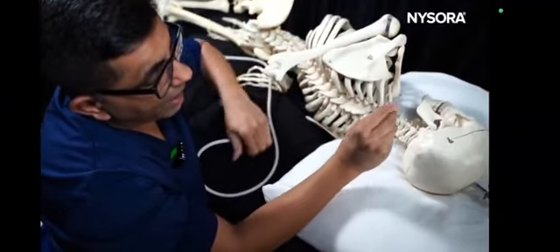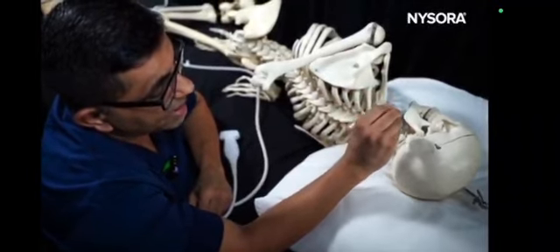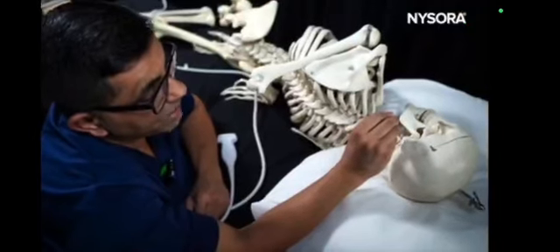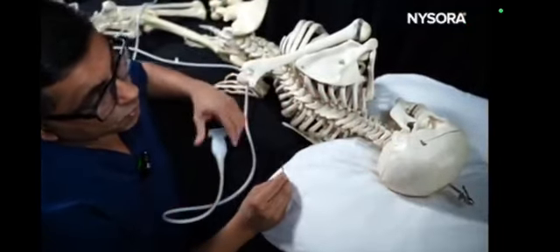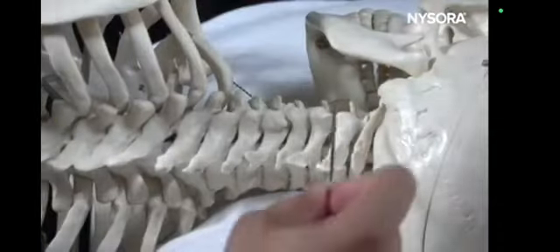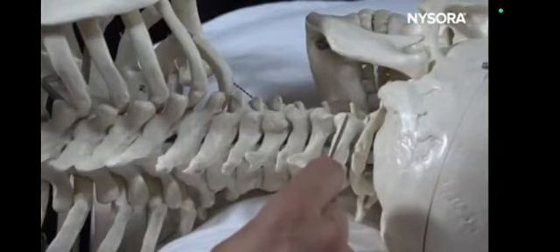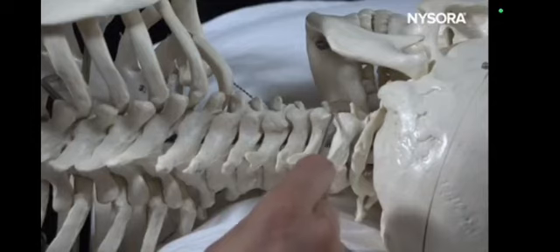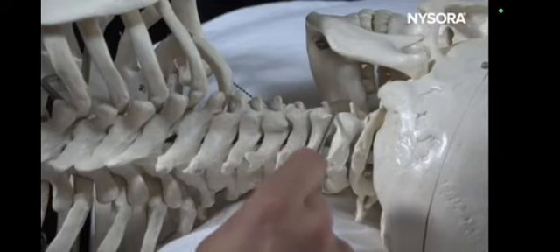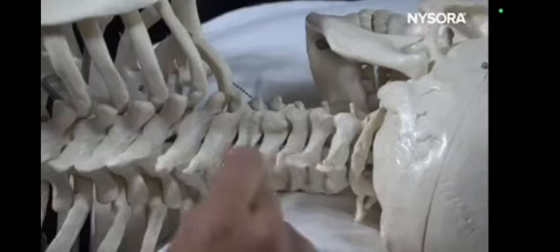But if you are doing an out-of-plane technique and you're heading from posterior to anterior, and if you miss the bony target, you will end up either in the vertebral artery or the nerve root. So to recap, start with the mastoid process, move down, and look for the first joint, which is the C2-C3 joint. Look for the third occipital nerve, and then look for the peak and the trough, peak and the trough, peak and the trough. Peak is where you have a facet joint, and trough is where you have the medial branch located.